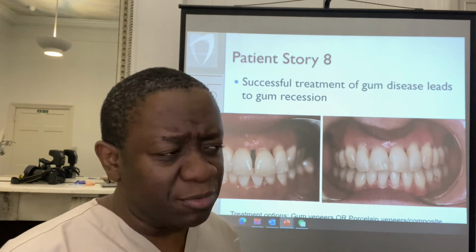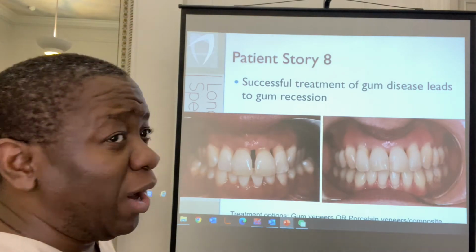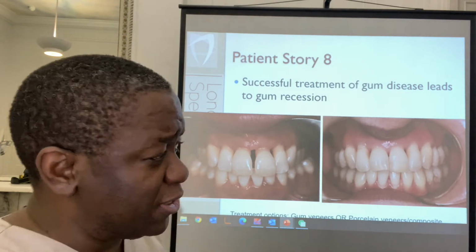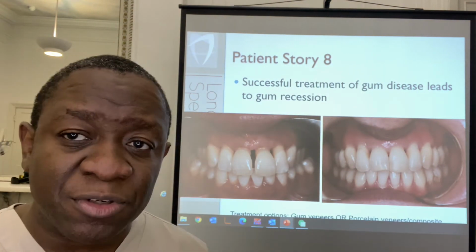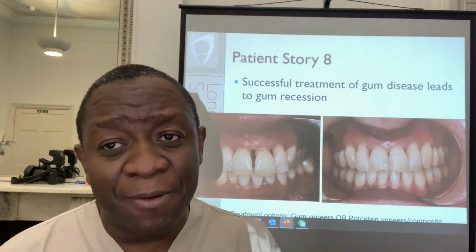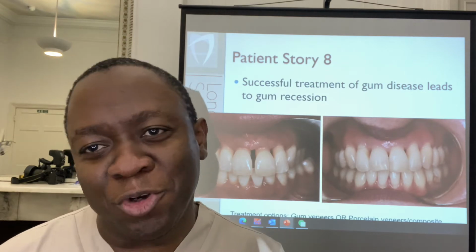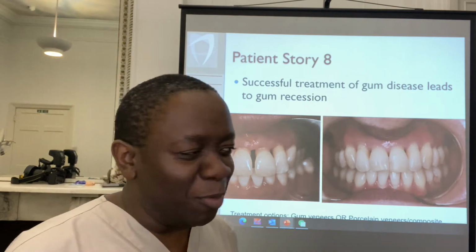Now, the reason why I tend to prefer to recommend the gum veneer over the porcelain veneers or the composite bonding is really very simple. Successful management of gum disease requires excellent control of plaque, so excellent oral hygiene, and these large gaps are much easier to clean than smaller gaps. So if you have a gum veneer, then it's easy to remove it for cleaning and replace it afterwards. Now, please bear with me because I know that some of you don't like the thought of gum veneers, but I'm hoping to persuade you over the next couple of minutes.